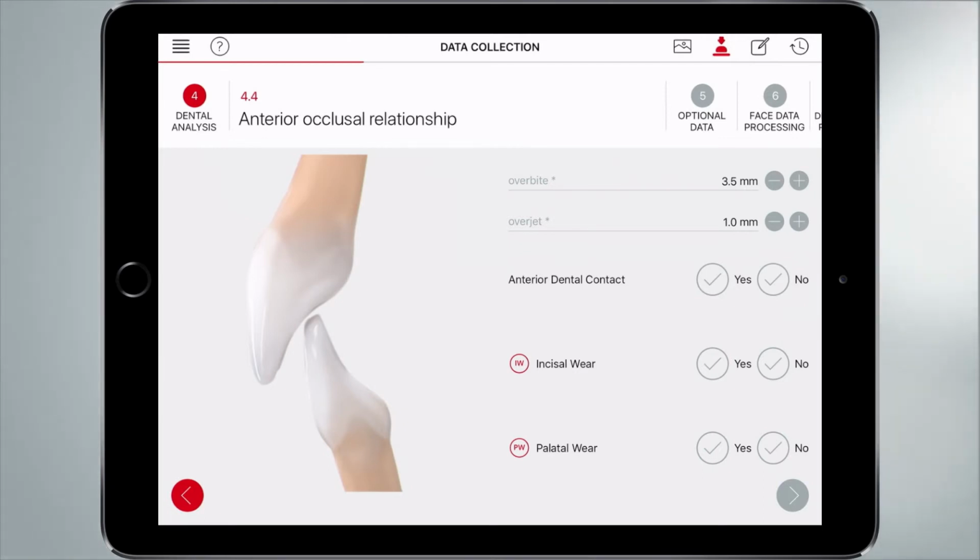And also the value of the incisal wear, because remember, this patient has a big, important wear. So the incisal edge thickness is about a couple of millimeters. It means that it is quite an important incisal edge value. Normally it is about 1 millimeter.